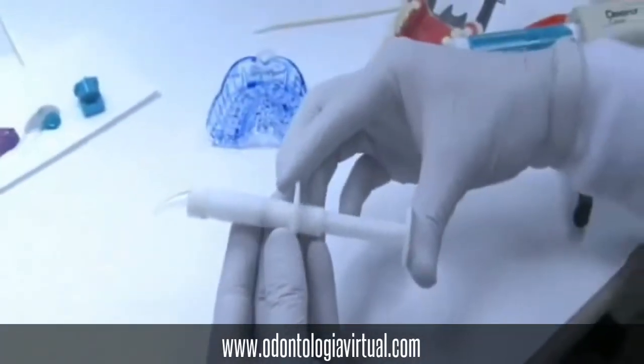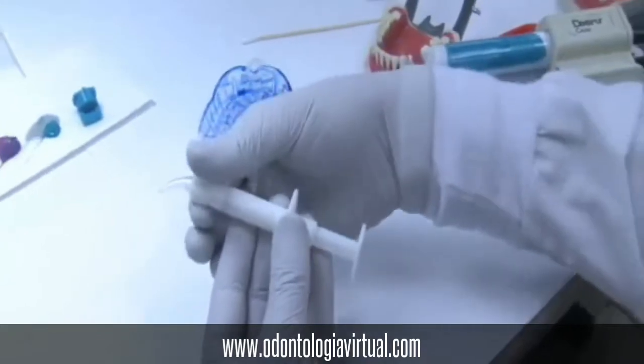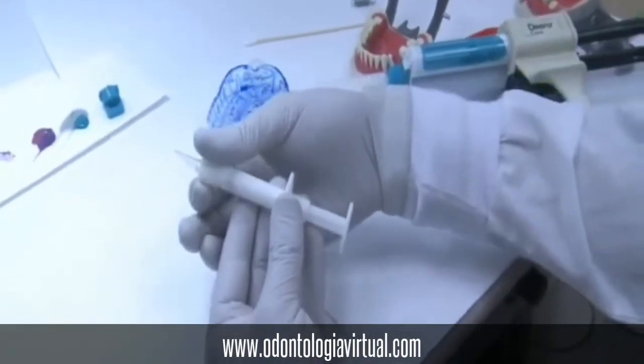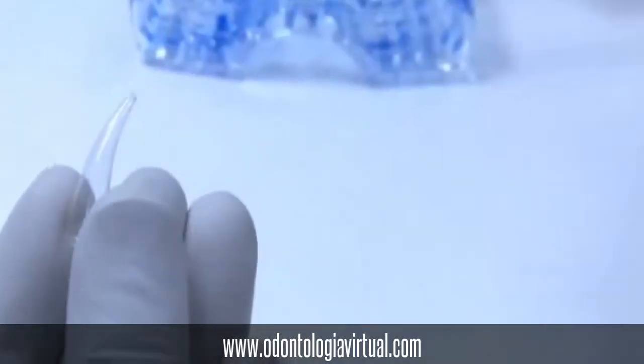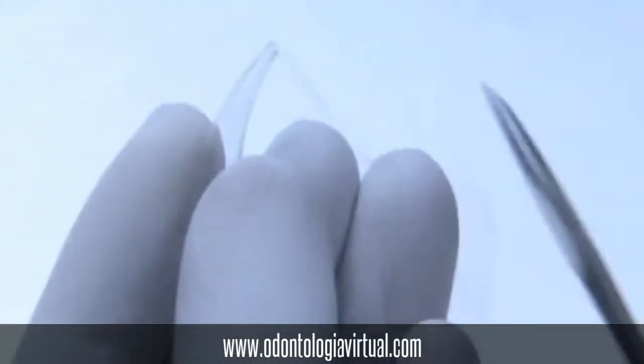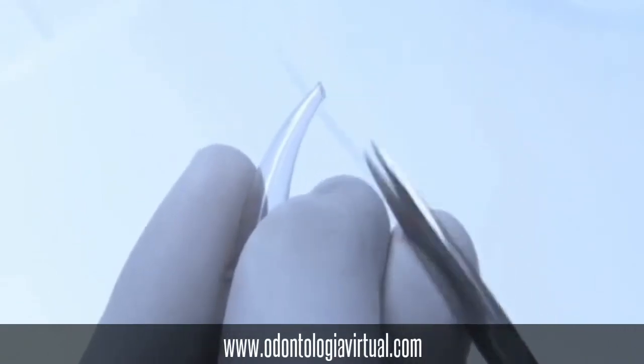For the light body we will be using a Kerr free flow syringe, which has a plunger as well. We will remove the tip, and make sure when you remove the tip that you cut it with a pair of scissors so that you have enough material flowing through.